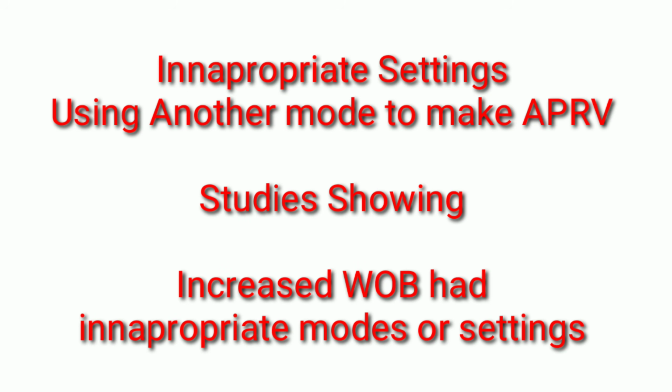Also, some people were modifying other modes, trying to create APRV. However, often in the traditional modes, there's a trigger that is created on the P high. So not using true APRV modes and kind of hybriding and just setting it up that way on top of it, probably the researchers had not become proficient enough to really know what amount of air trapping had to occur.